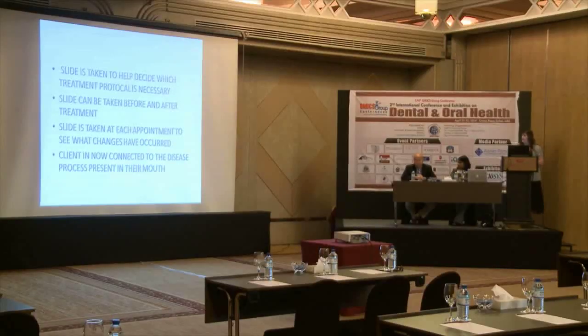A slide is taken to help decide which treatment protocol is necessary. You can take a slide before and after treatment to show them the difference. The slide can be taken at each appointment as well. And now the client is connected to the disease process in their mouth.